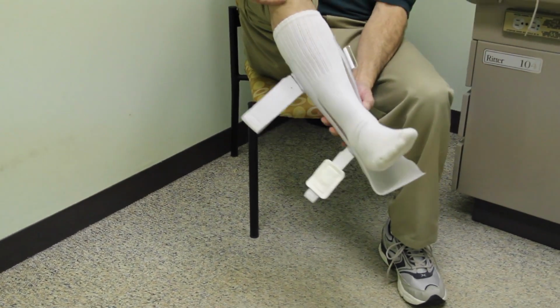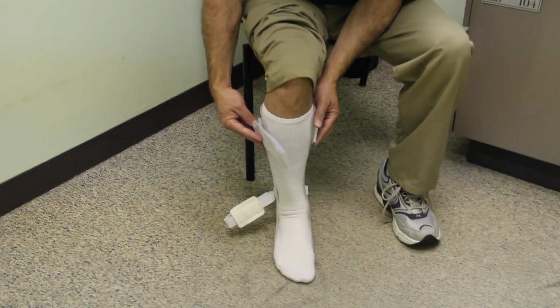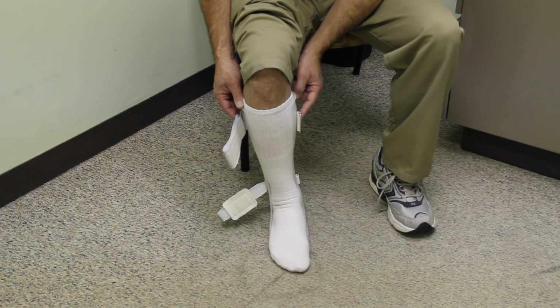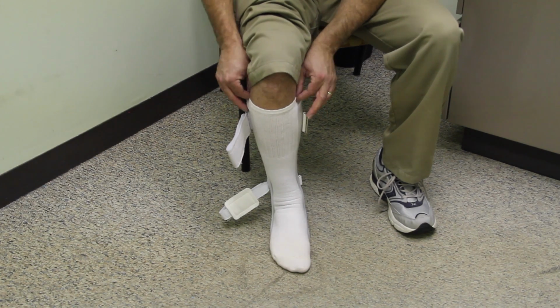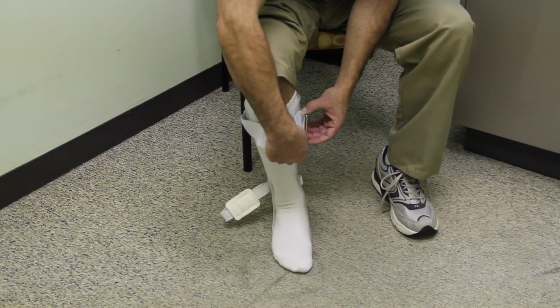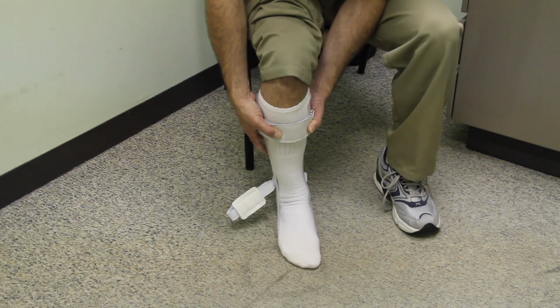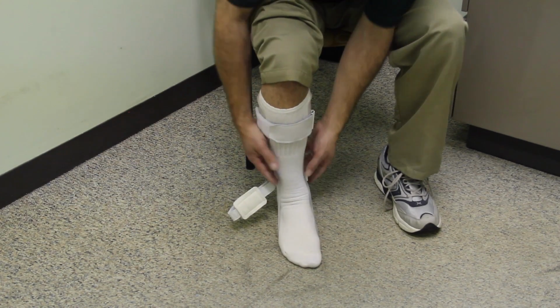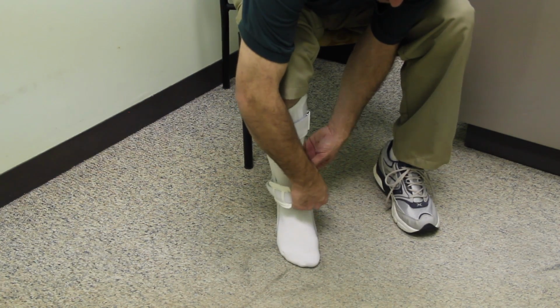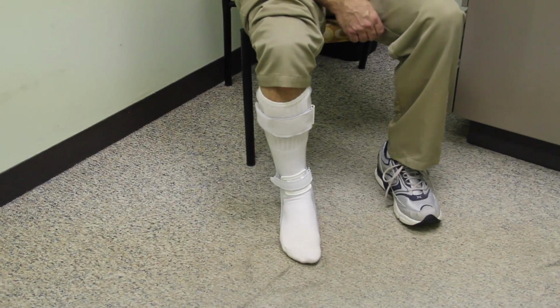The white cotton socks tend to wick away the moisture really well, so they tend to be very helpful. A lot of people have some different reactions to the plastics and even the nickel on the rivet, so having a full-length sock is what's recommended. We use both a calf and a supramalleolar strap to help immobilize my ankle and keep me locked in to eliminate pistoning while walking.